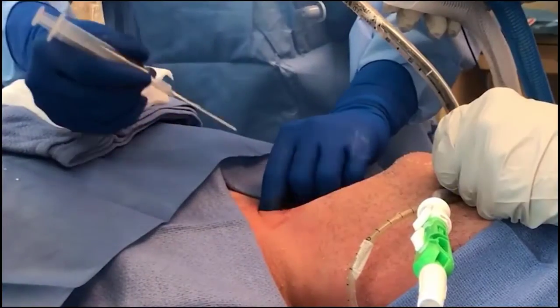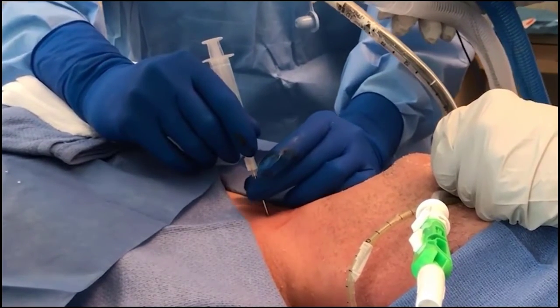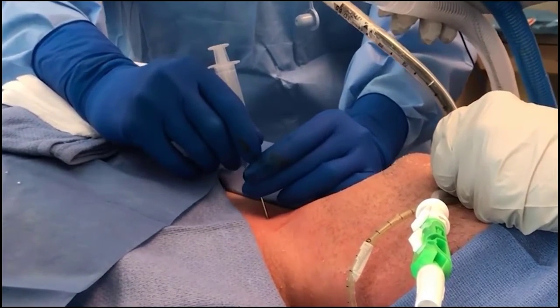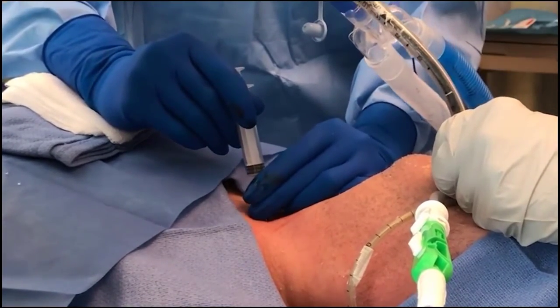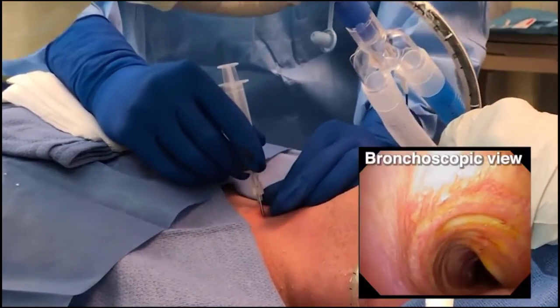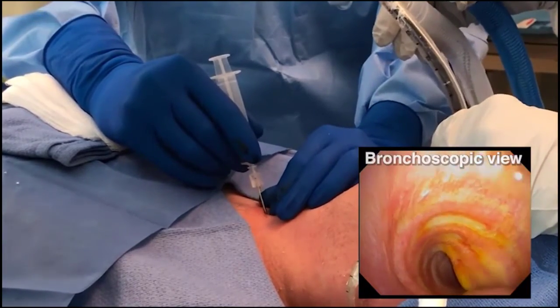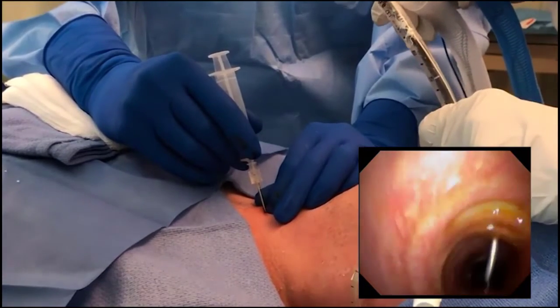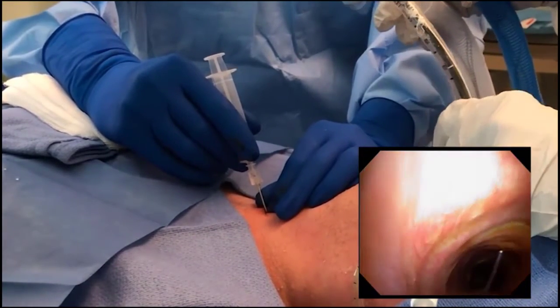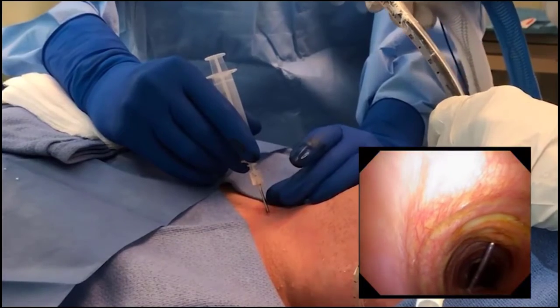Precise communication and coordinated movements between the respiratory therapist and bronchoscopist are crucial to prevent accidental extubation. Once the oral endotracheal tube has been withdrawn to an appropriate location, perform the tracheostomy using the Seldinger technique. Insert the introducer needle through the anterior wall of the trachea under direct bronchoscopic visualization. The needle should be inserted at approximately the level of the second tracheal ring, perpendicular to the trachea with the bevel facing down. Placement of the needle bevel in this downward position will help to direct the guide wire into the distal trachea.